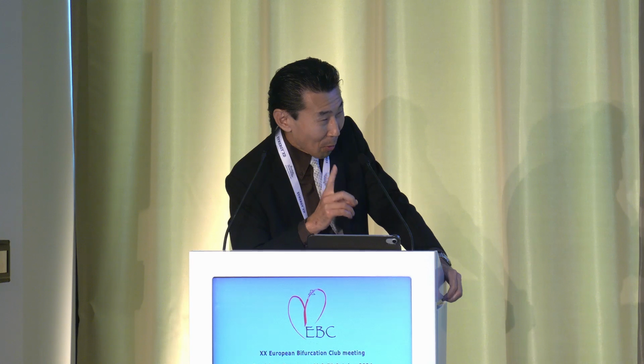Thank you very much. Yes, difficult question. There is a difference in wire stiffness between the support wire and the soft wire. However, both are metal, so I think there is not so big a difference.